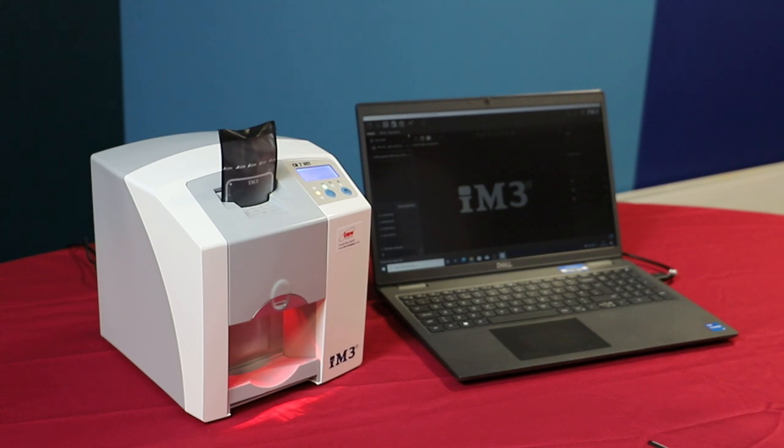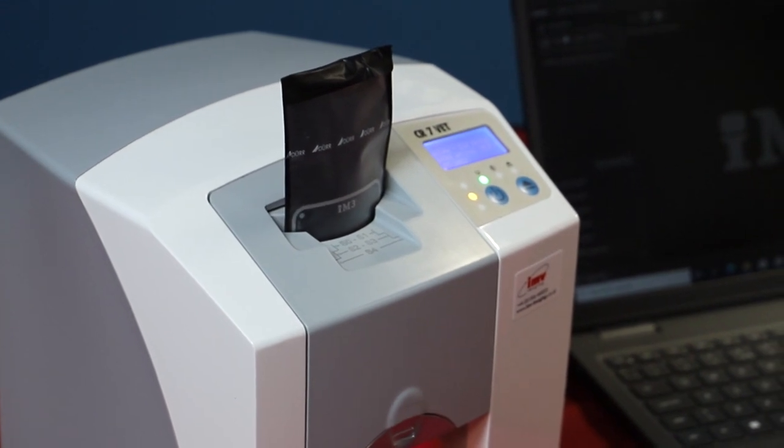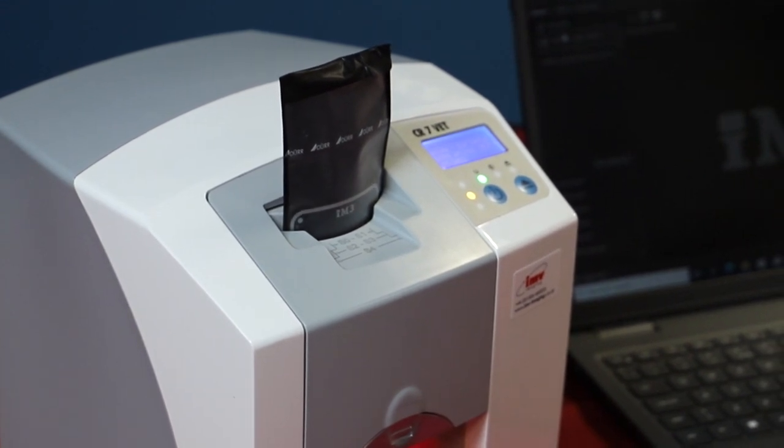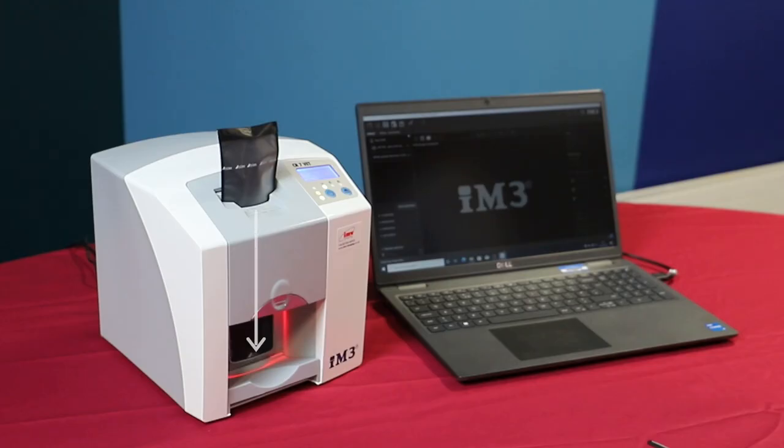As your image is being processed, it will show up on your Vet Exam software. Once the plate has been processed, you can then review your images.